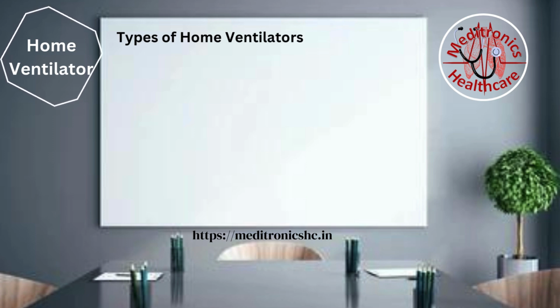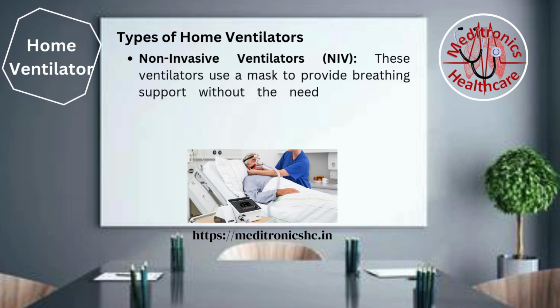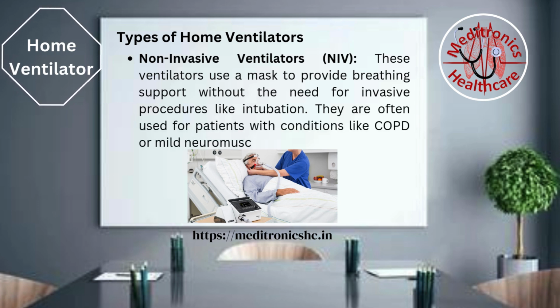Types of home ventilators. Non-invasive ventilators, NIV. These ventilators use a mask to provide breathing support without the need for invasive procedures like intubation. They are often used for patients with conditions like COPD or mild neuromuscular disorders.